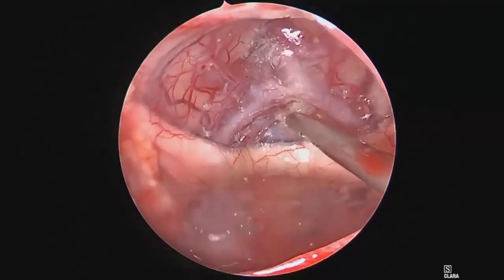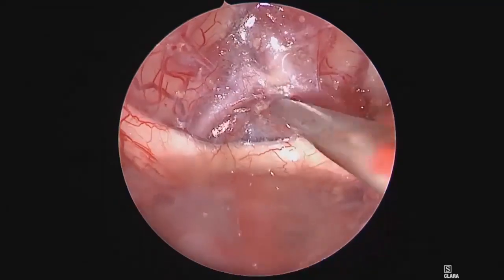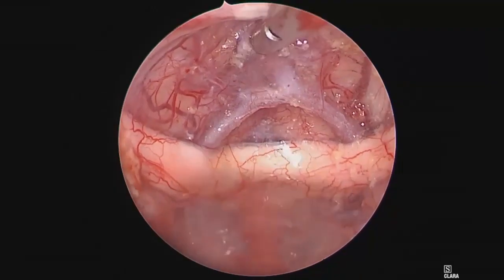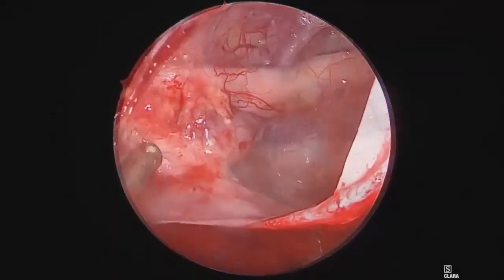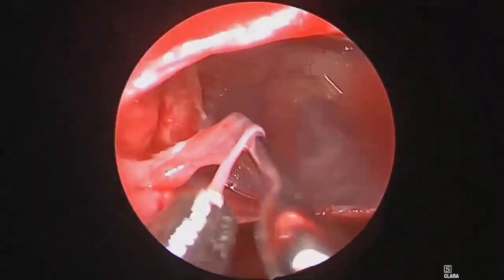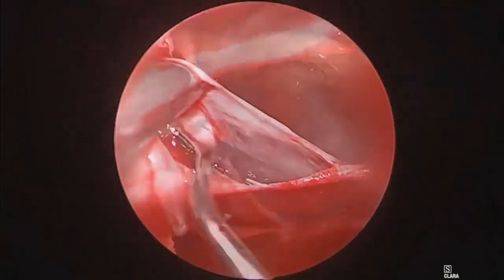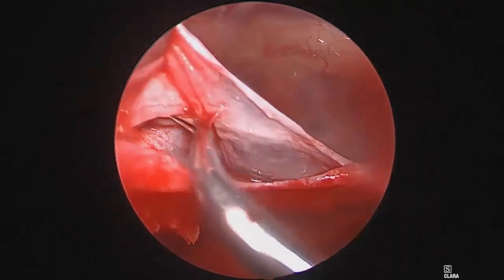Direct inspection of the thin veil of arachnoid reveals some residual disease implanted into the arachnoid that can be carefully suctioned without injuring underlying vascular structures, and particularly perforators that are supplying the optic chiasm. Continued inspection of the surgical cavity reveals a small residual of dermoid inferior and medial to the right optic nerve that's causing compression. Careful microdissection technique with blunt instruments is used to separate this residual from the underlying clinoidal carotid. Injury to the carotid here can be devastating.